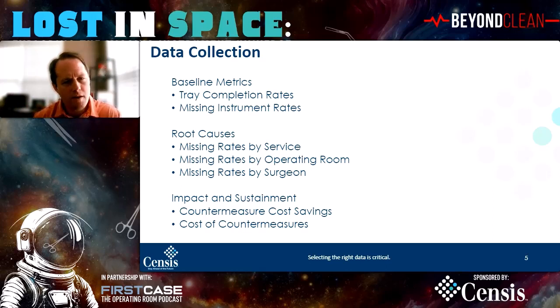The challenge they ran into is that there are metal things that legitimately go in that trash, and those would set off the metal detectors. But that's one way they go missing. We also found that, for whatever reason, residents like to borrow instruments. I'm not sure even now exactly why, but residents tend to borrow a lot of instruments.